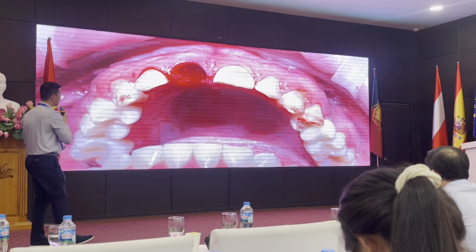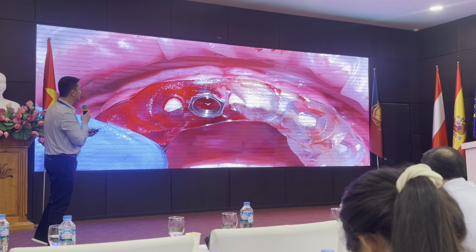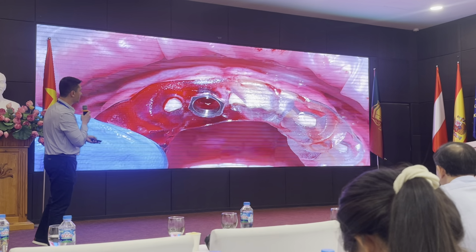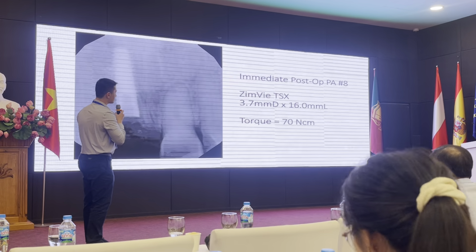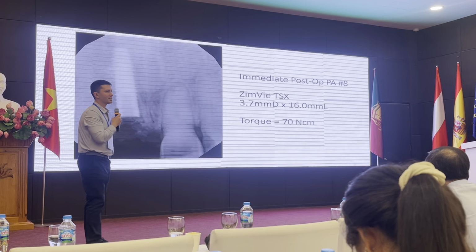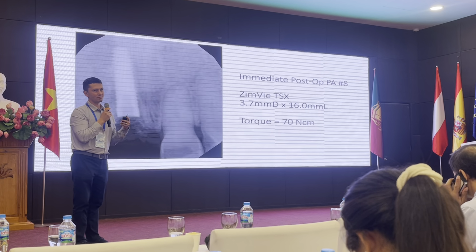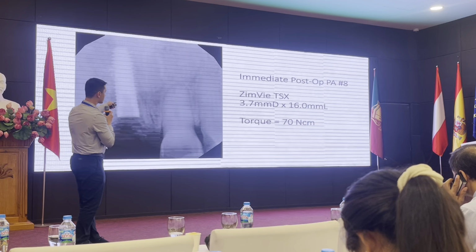So we design the guide, we extract the tooth, same protocol, seat the guide, measure, and make sure that the cutout windows here are fully seated with the teeth. We know that the guide is fully seated, and we place our implant. 70 newtons of torque, 70. This procedure took maybe 20 minutes from start to finish, the surgical part.